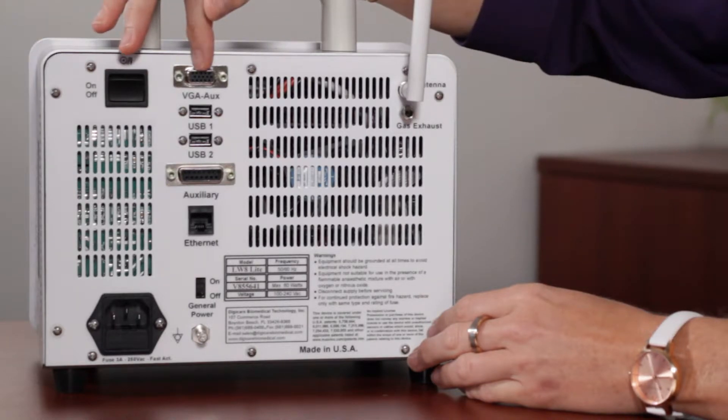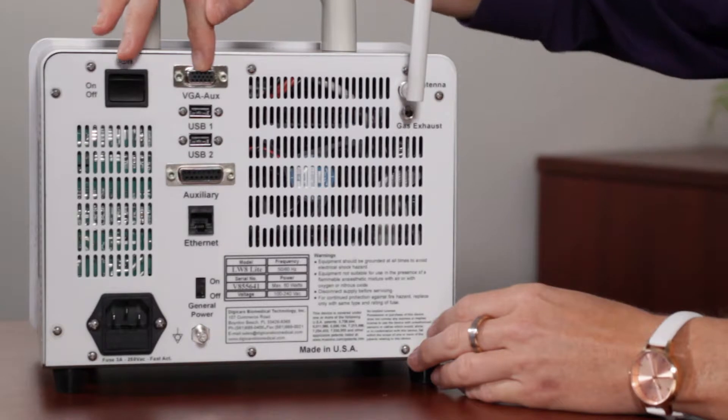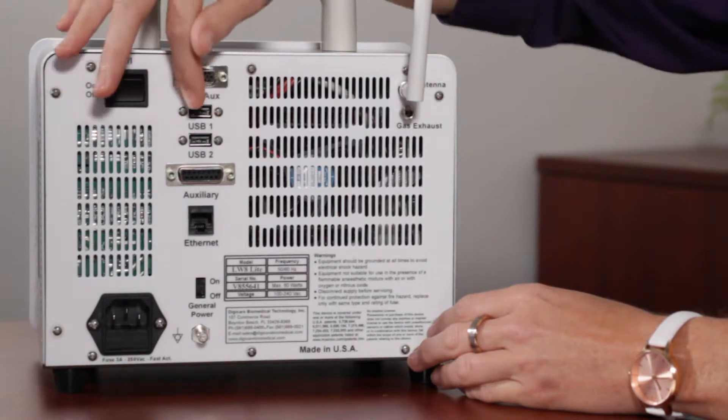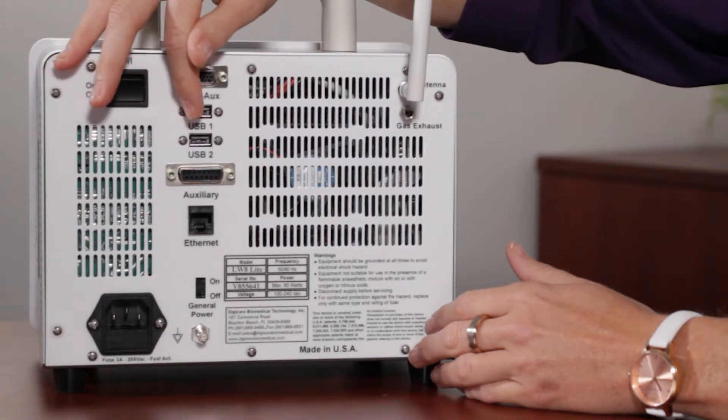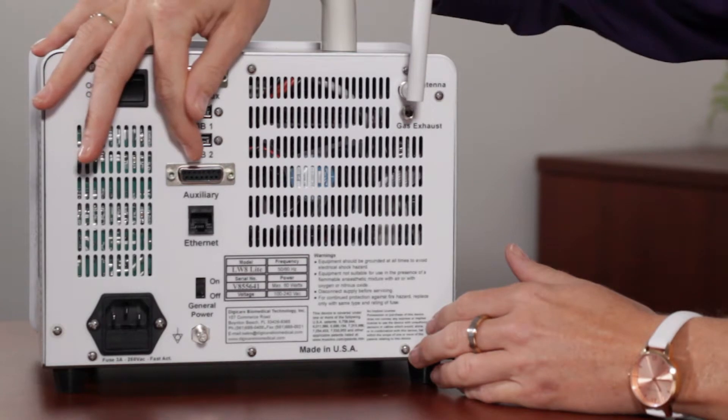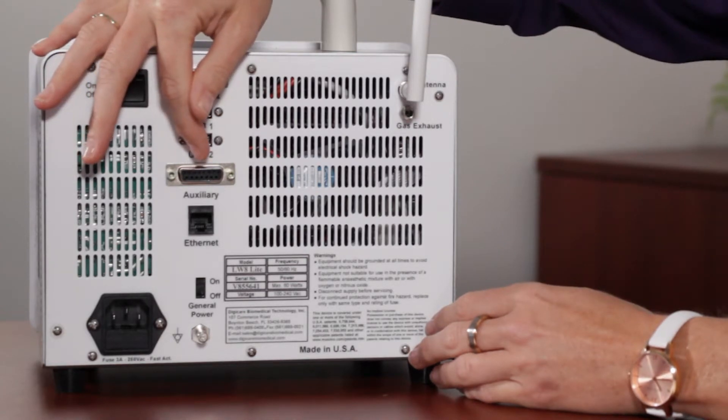The VGA is so you can connect a bigger screen to the monitor. There's two USB ports. You can put a USB thumb drive in them to save data. You can attach a keyboard, mouse, or printer. The auxiliary is for analog output signals.